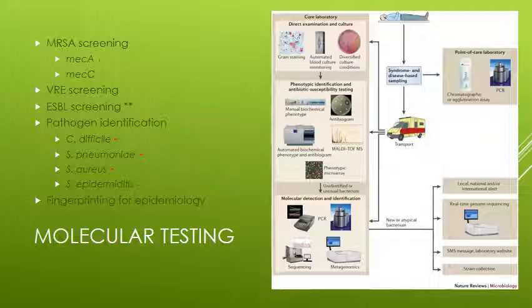And then also there's PCR fingerprinting, where we do actual gene sequencing of bacteria that's very highly useful for epidemiological purposes.